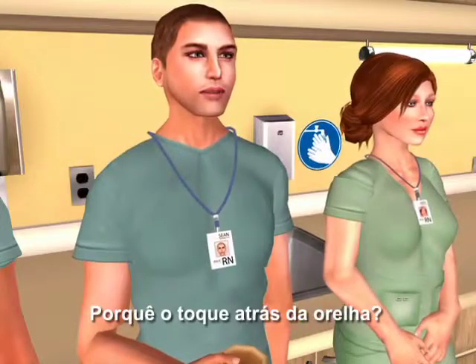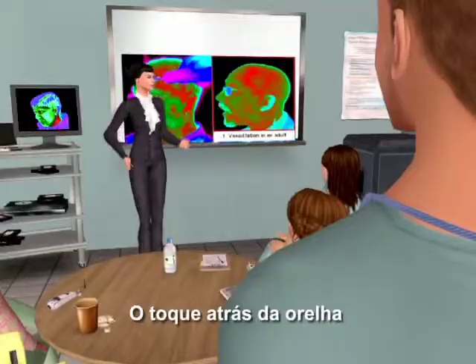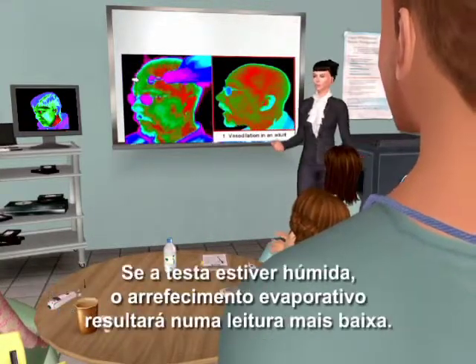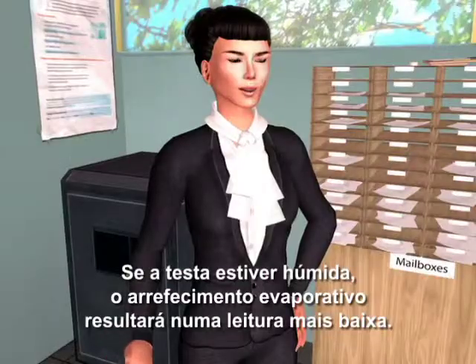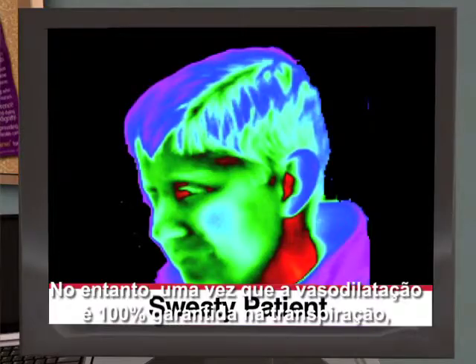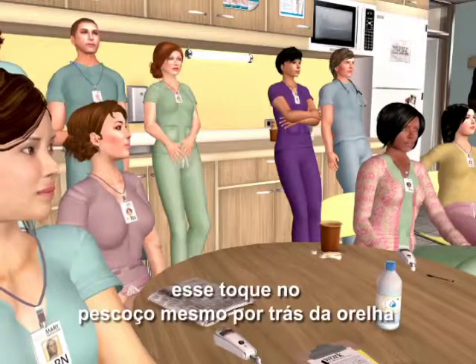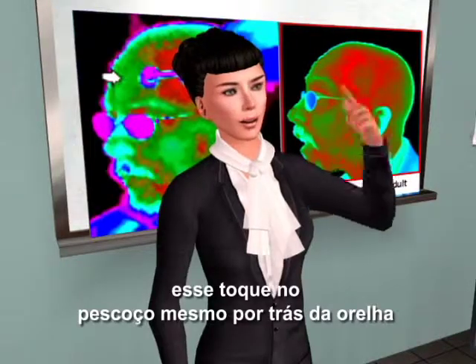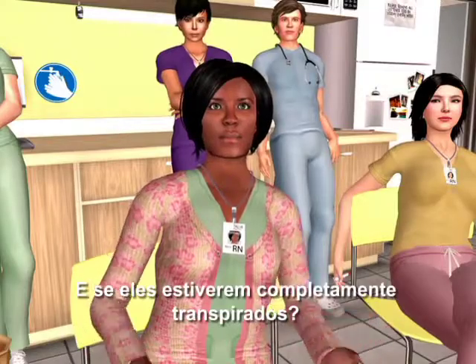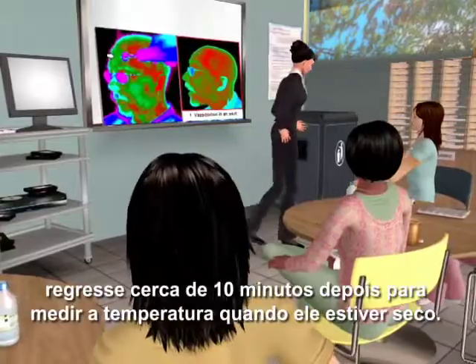Why the touch behind the ear? The touch behind the ear is to assure the correct reading if the patient is sweaty. If the forehead is moist, evaporative cooling will result in a low reading. However, since vasodilation is 100% assured when sweating, and we sweat least on the neck, that touch on the neck just behind the earlobe will override the effect of evaporative cooling. If the patient is completely sweaty, return in about 10 minutes to take the temp when they're dry.